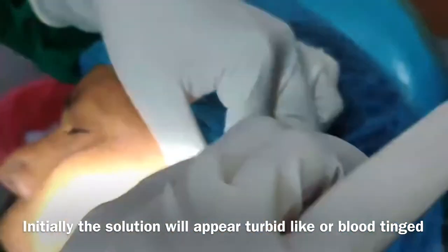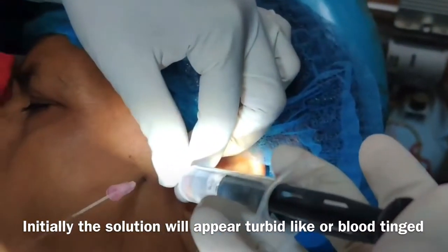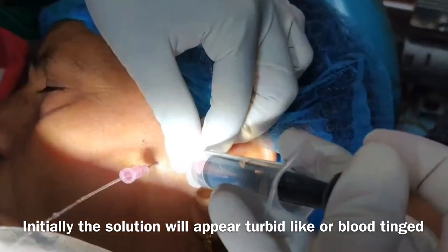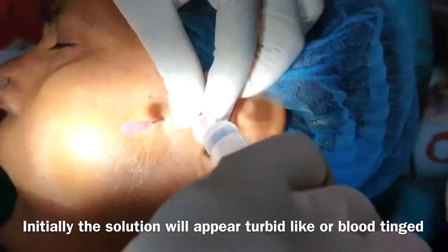Initially the solution will appear turbid or blood-tinged — here you can see it is opaque and not clear. But as you keep flushing, at last it will appear very clear.